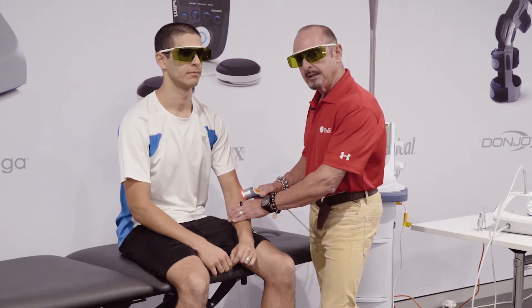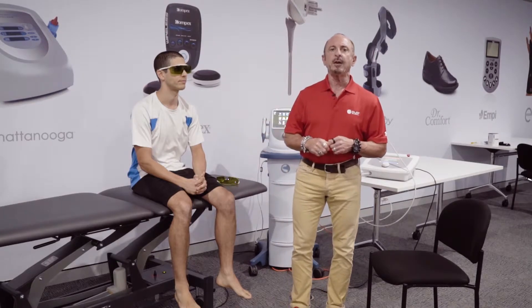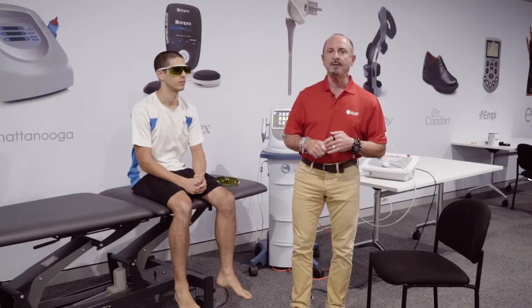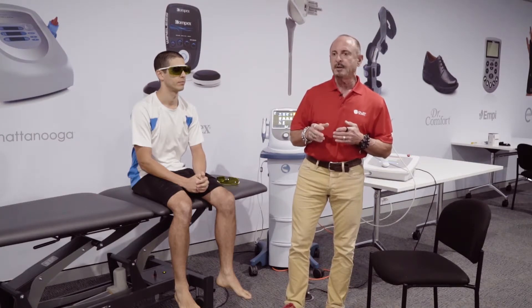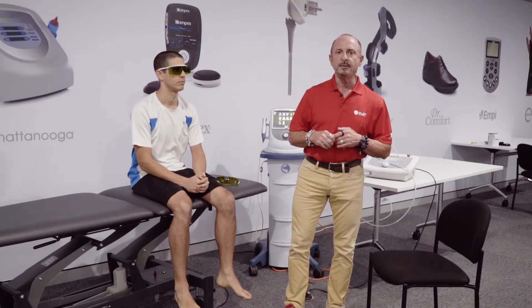Now for our high-power treatment, we're going to use the Chattanooga high-power laser, 15 watts. What's unique about this unit is it utilizes three different wavelengths: 810nm, 980nm, and 1064nm. These emission modes are each responsible for delivering a number of different therapeutic effects.